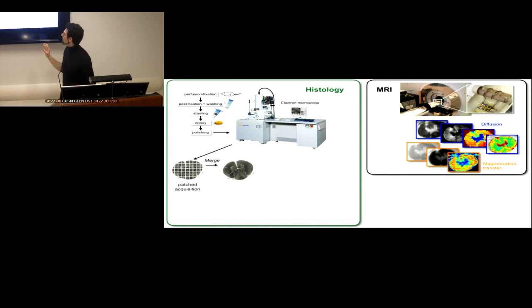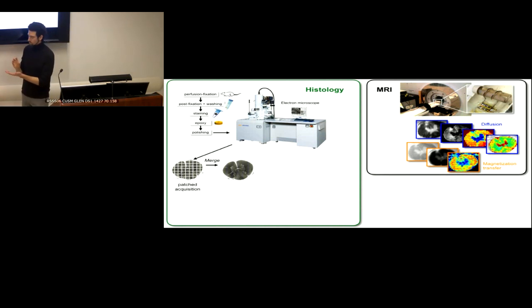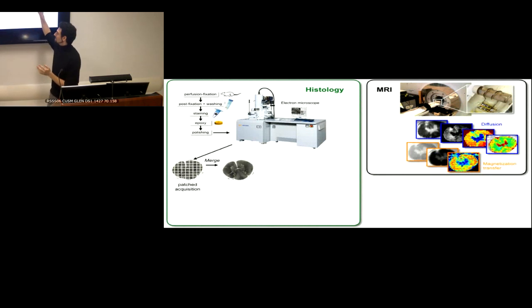Most of the electron microscopy work when we want to look at microstructure is usually using transmission EM because we can get very high resolution and look at the actual ultrastructure of the axons and the myelin. In our case, it's kind of a difficult job because we cannot play with 2 nanometer resolution and then compare our big voxels from MRI because the acquisition would take years, right?